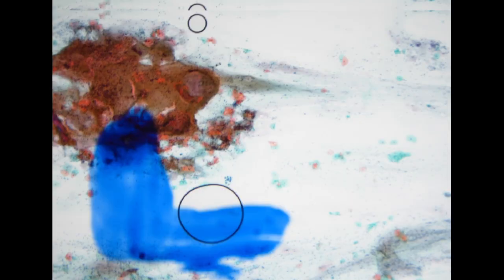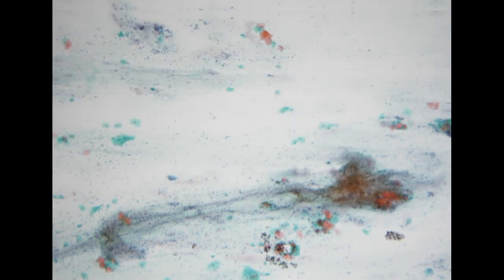Initially, our clinicians did a colposcopy biopsy, which was negative, and they also did HPV testing, which showed other high-risk positive HPV. After 3 months, this is her follow-up specimen for pap smear. So we know that the patient had a positive pap smear before, not in our hospital, and a positive HPV.